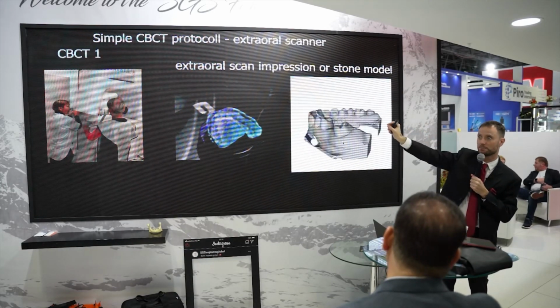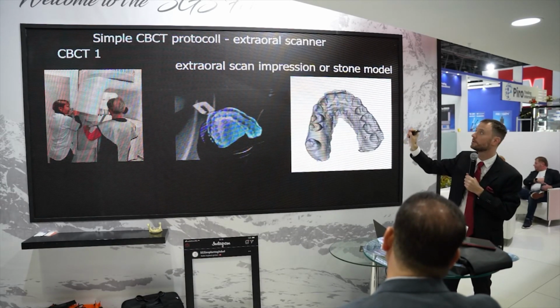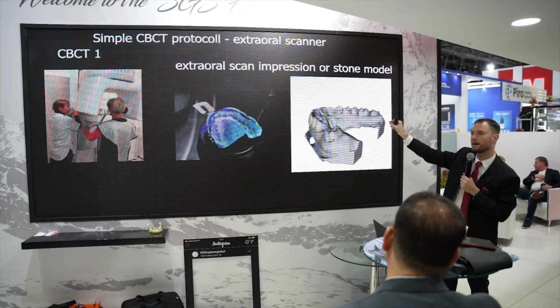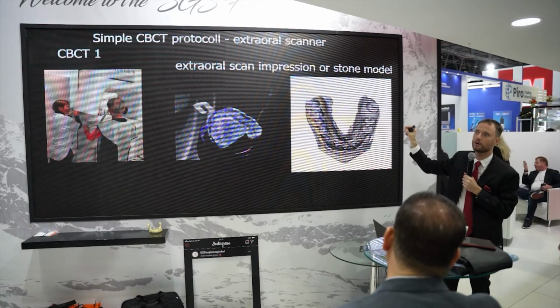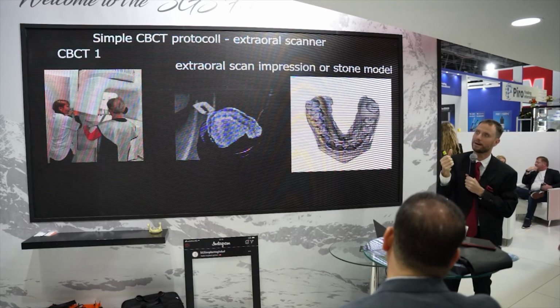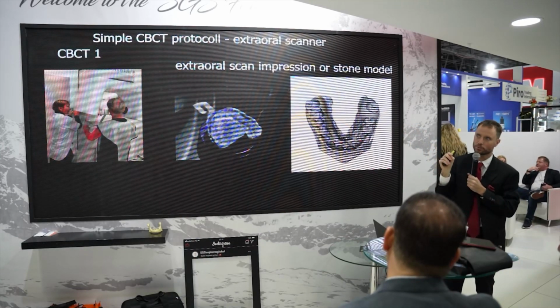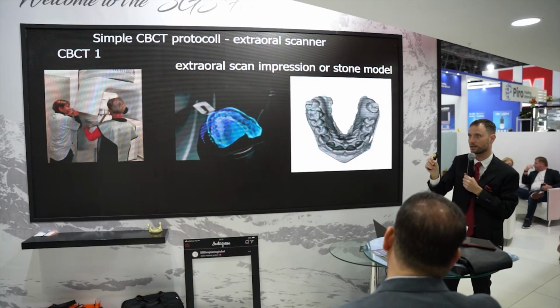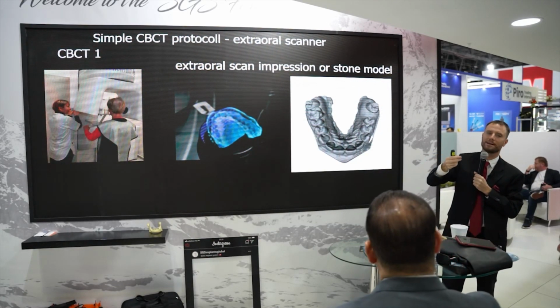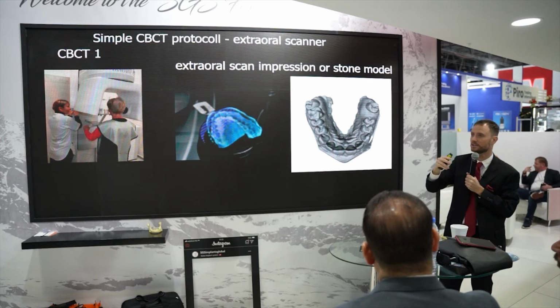As I don't have the GP reference points, you need to have the teeth as reference points. So my patient needs, for this case, 6 or 8 sound teeth. Sound means no metal. I can have composite filling, no problem. I can have ceramic crown or inlay, not zirconium, but pressed ceramic. So no metal artifacts, nothing that will cause distortion in the CT.